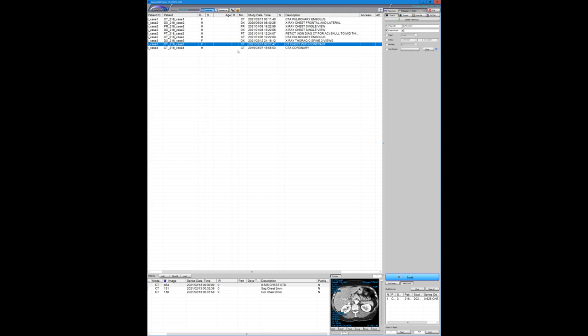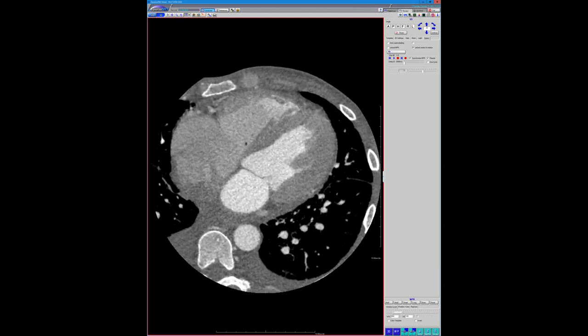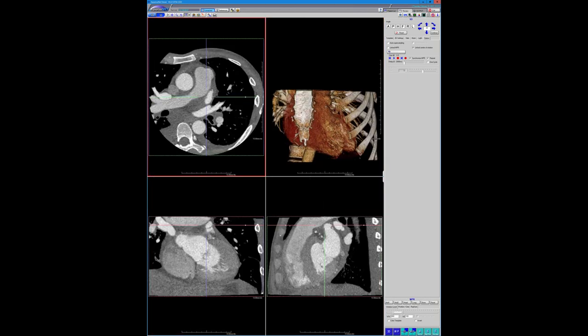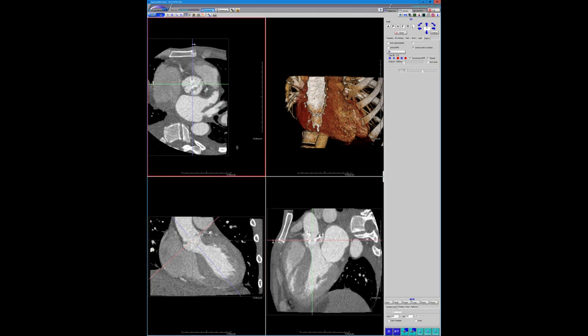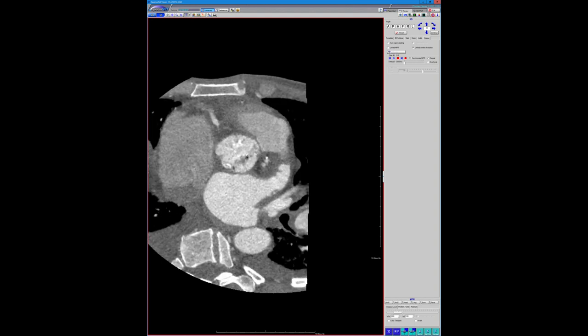Lastly is a case of endocarditis — not super exciting in that sense — but what is interesting is there is a portion of contrast outside the valve. This is a homeless guy who had a bicuspid aortic valve. You can see this clear pseudoaneurysm wrapping around the aortic root here. He went to surgery and unfortunately died.